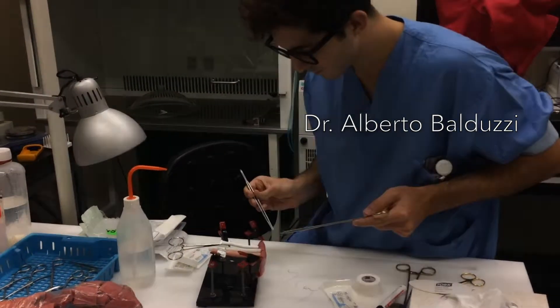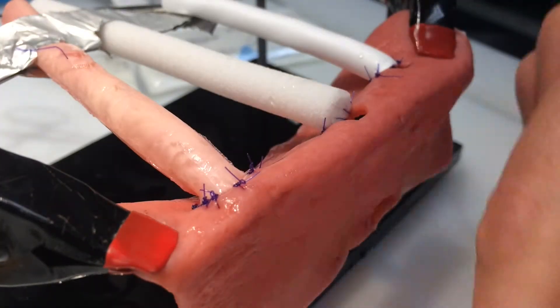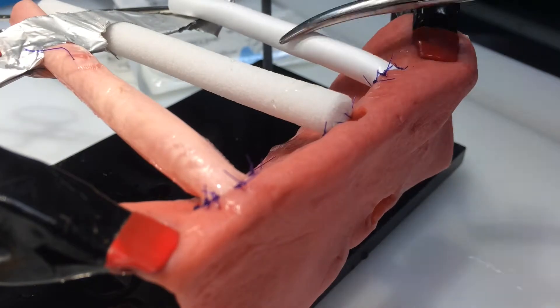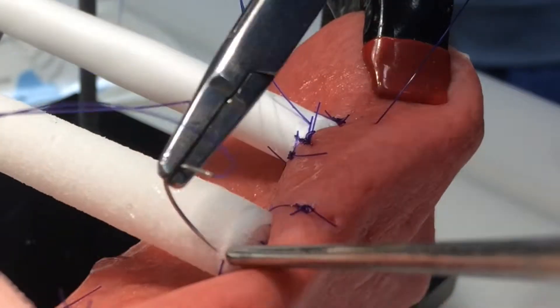For these anastomoses, I had the help of Dr. Alberto Bultuzzi. He's a research fellow at our academic medical center. The biotissue is made in Canada with a type of silicone. I just order a bunch of it to use for training.